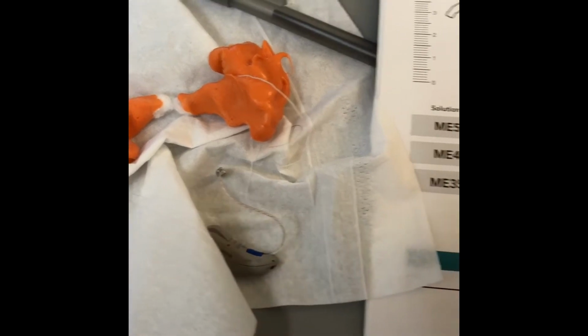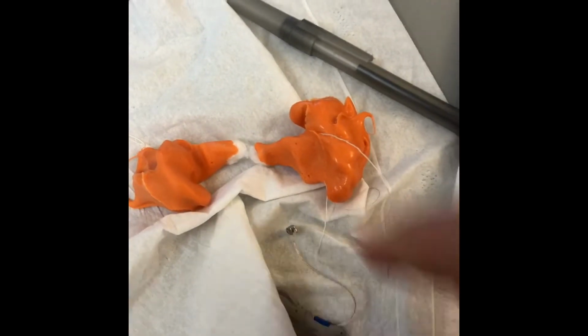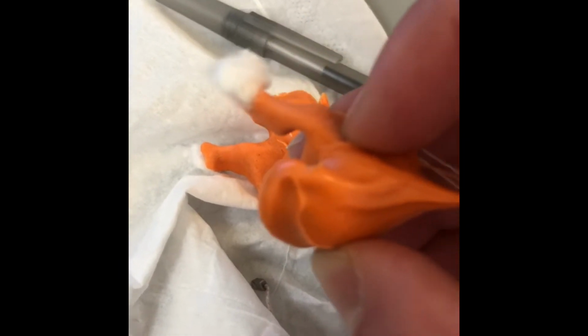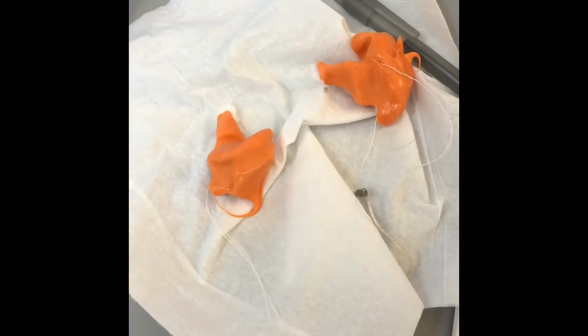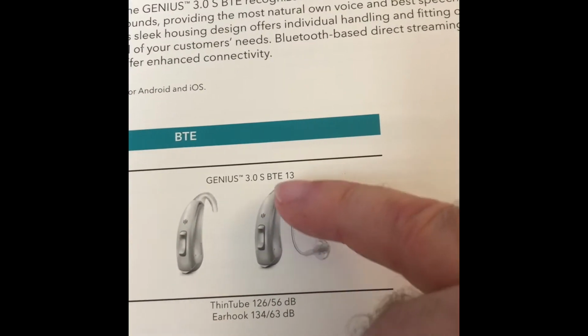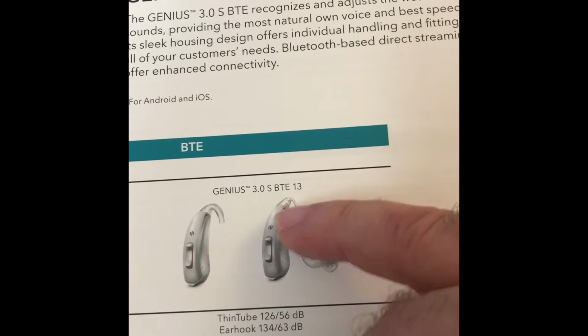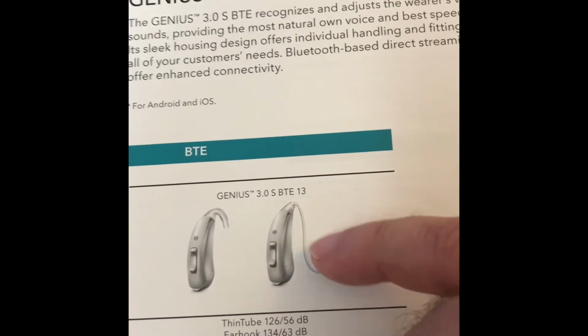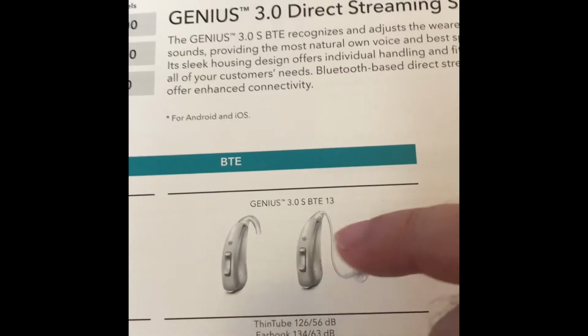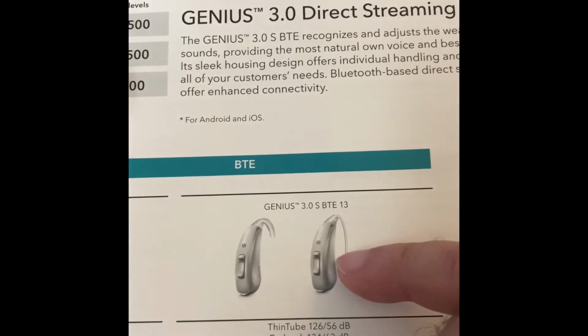The other reason it's going to stay in her ear better is that the ear mold is not going to expand the ear too much. Her right ear is very similar, by the way. And because we're using a tube with a custom mold on the end, that tube is firmer and more waterproof, since she's always getting wet and sweating. It's going to seal in her ear better, be firmer, and be more comfortable. So that's one reason she has to go.